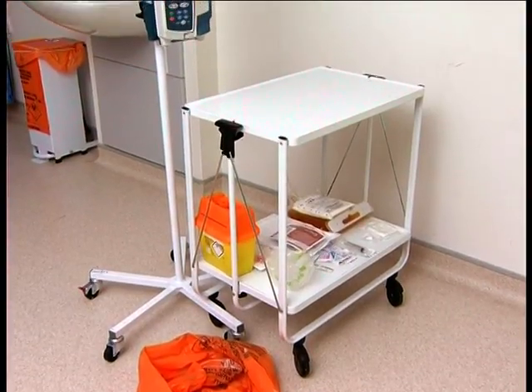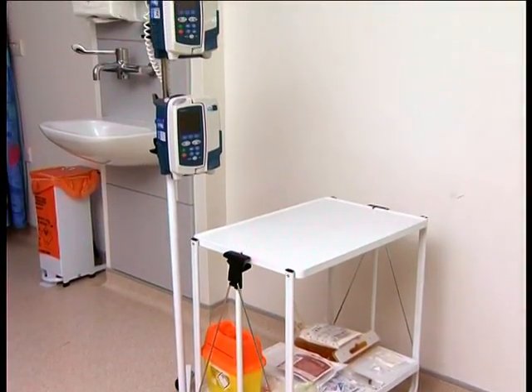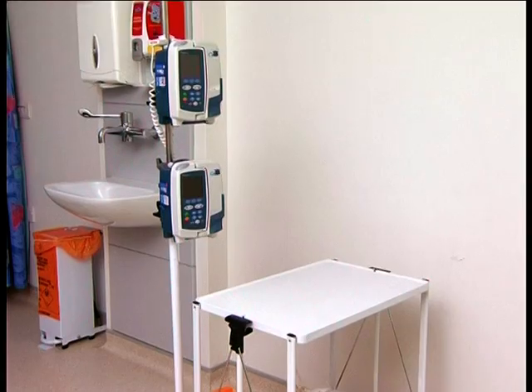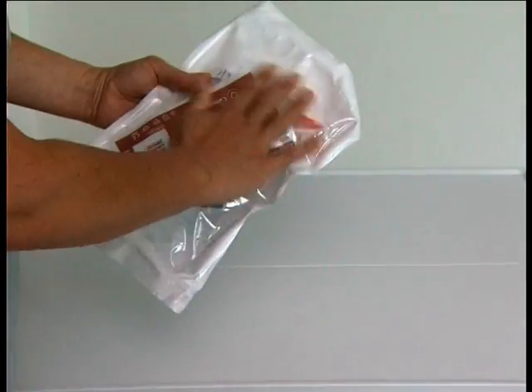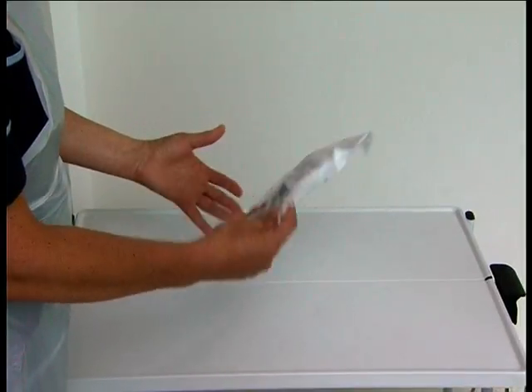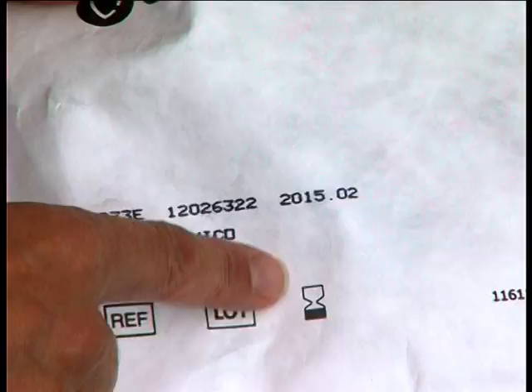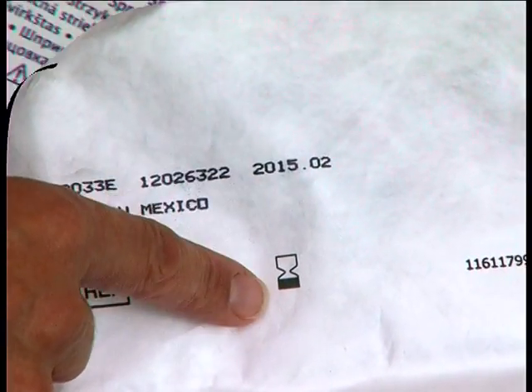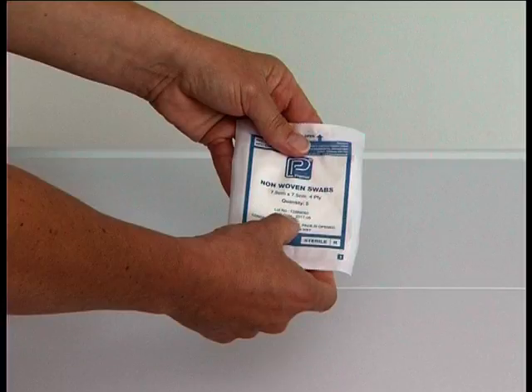Get all of the equipment that you will need for the procedure and place it on the bottom of your trolley or the other smooth hard surface area that you have cleaned. Check that the equipment packaging is not damaged in any way and does not appear to be or have been wet, which could mean that the contents are no longer sterile. Check that the expiry date is not passed. If there is any doubt that the contents of any of the packages may not be sterile, discard them.